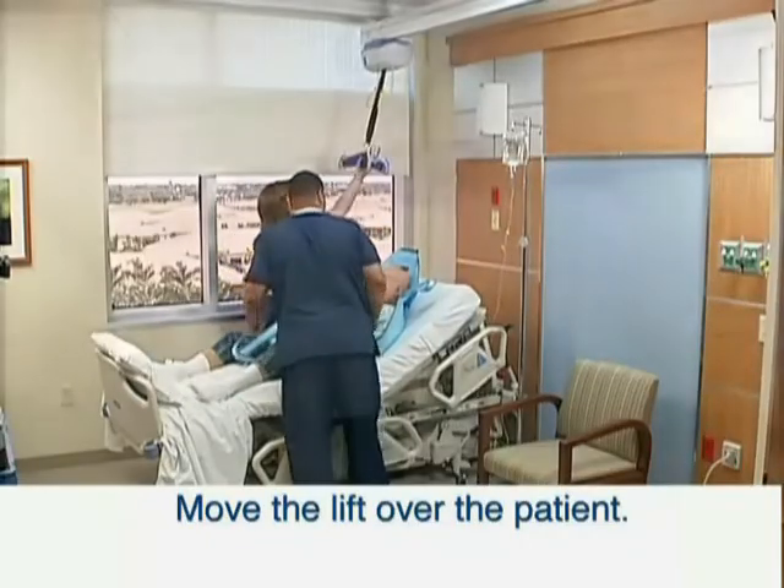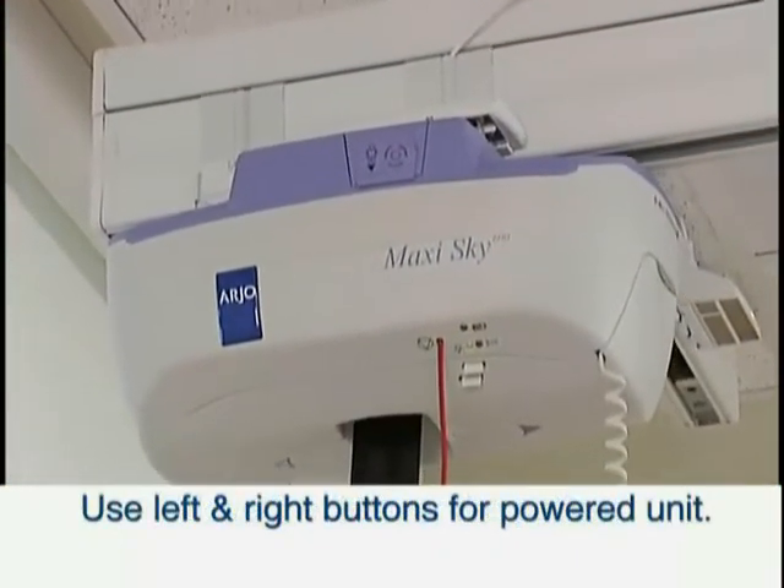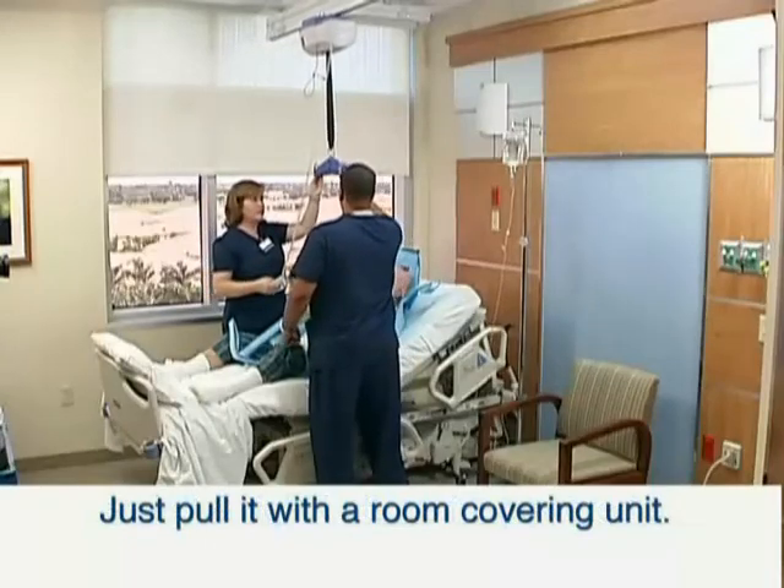Move the lift directly over the patient. Use the left and right buttons on the hand control if it is a powered motor, or pull the motor to the transfer point with a room-covering layout.